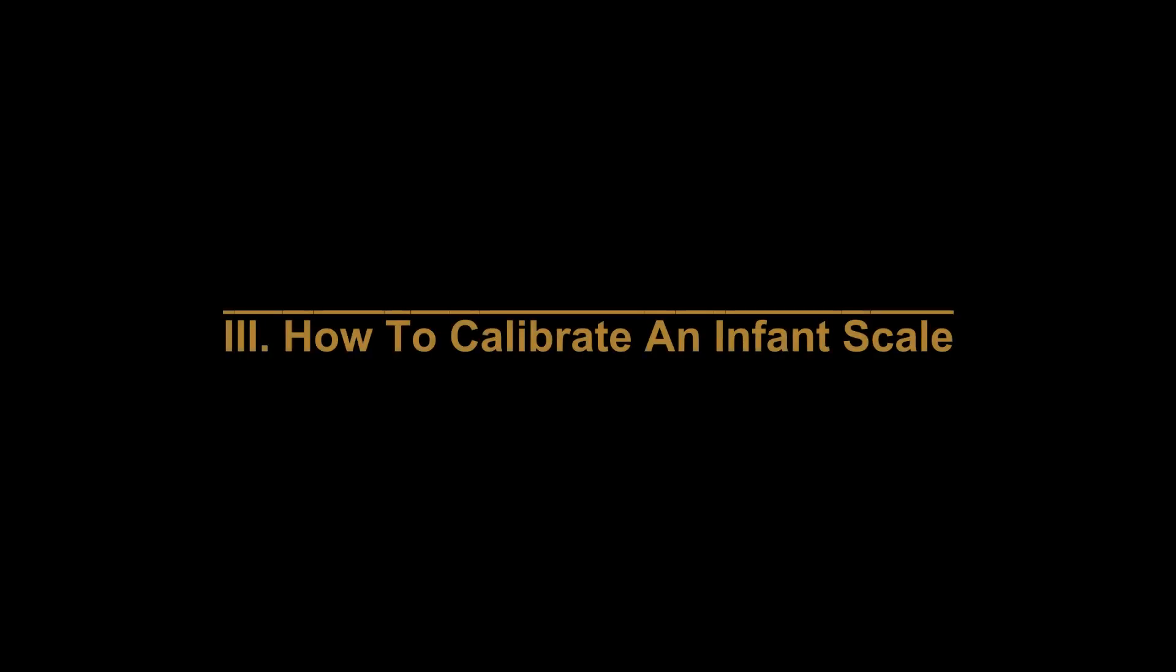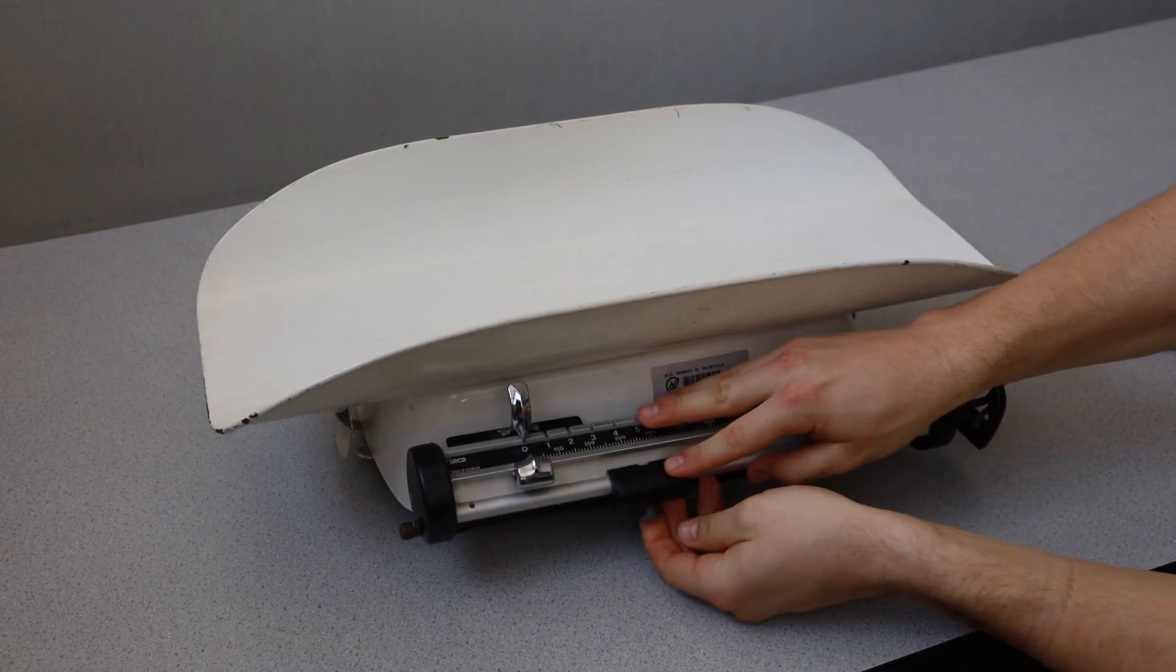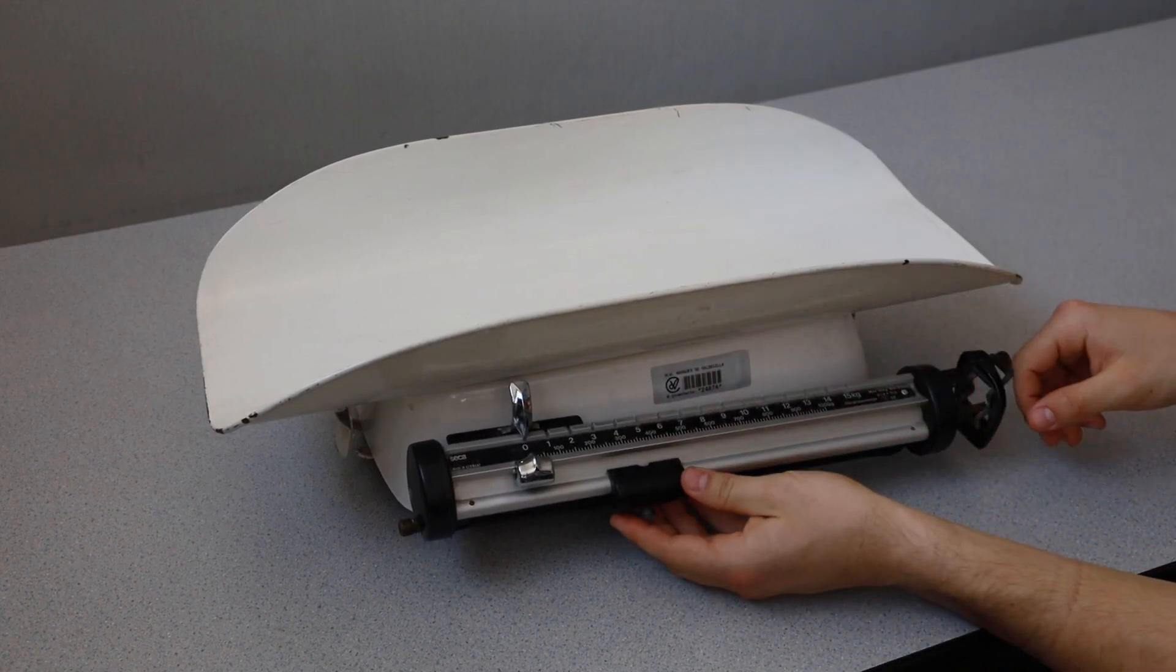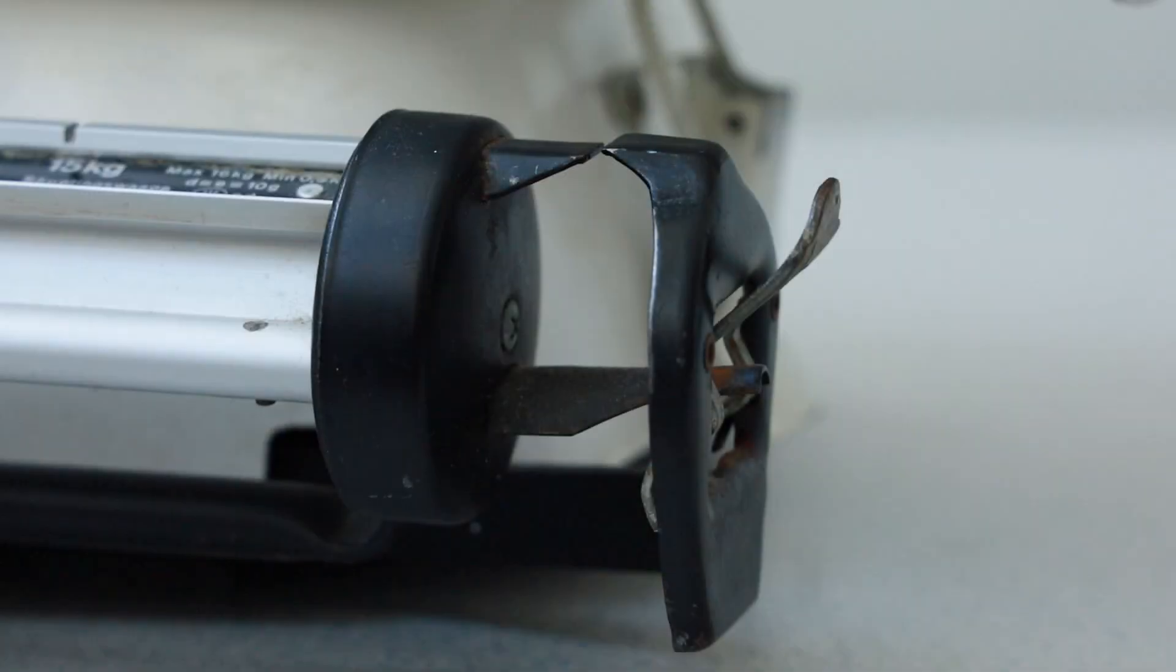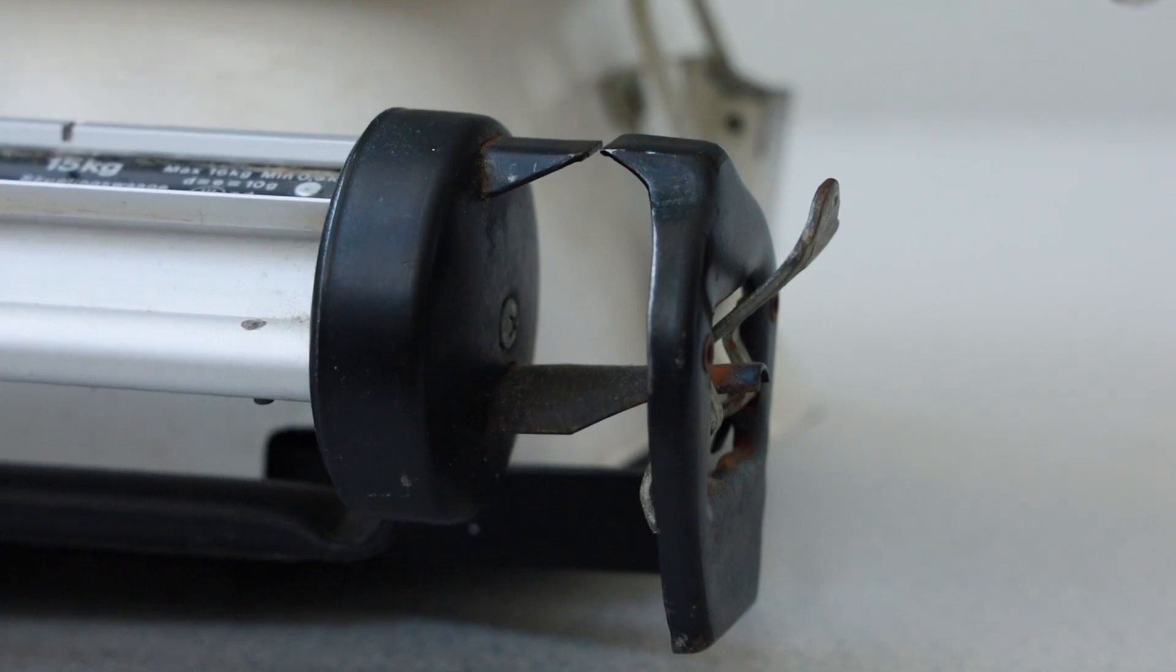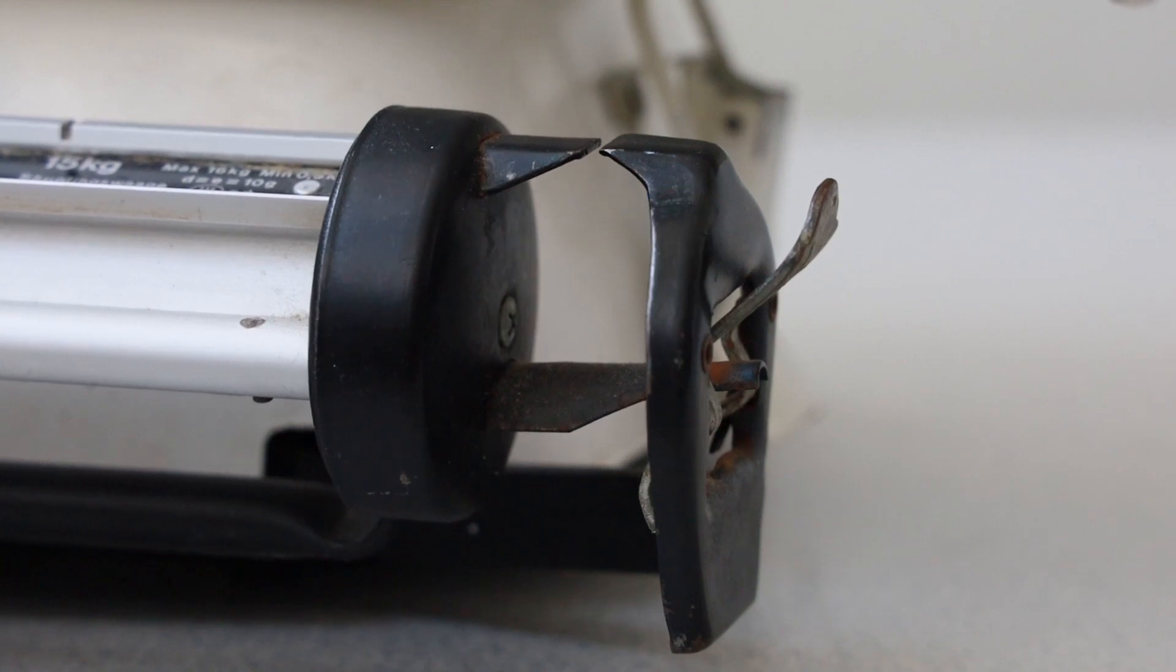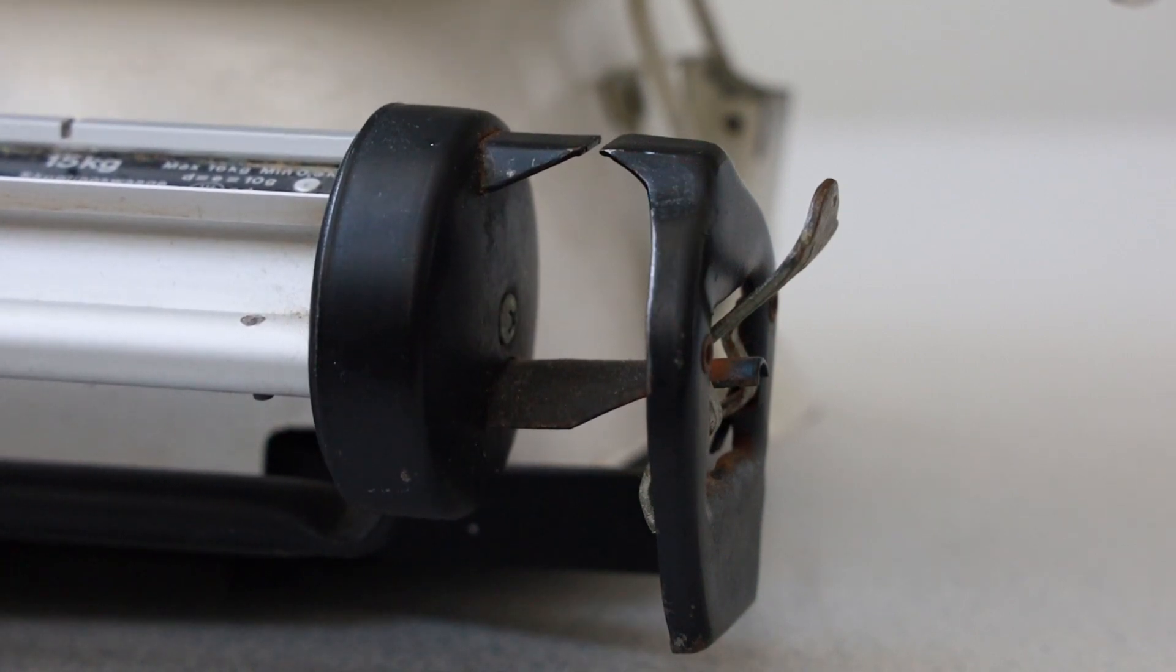We will now discuss calibrating the infant scale. Before the scale is used for weighing, it must be calibrated to ensure that the measurement of the baby is accurate. A scale is properly calibrated when the beam balance is level with no weight present on the weighing tray, or in other words, when the pointer and the counter pointer are aligned with each other without any weight on the scale.